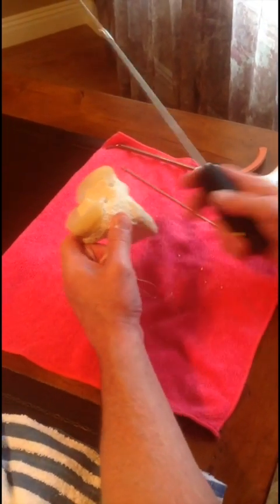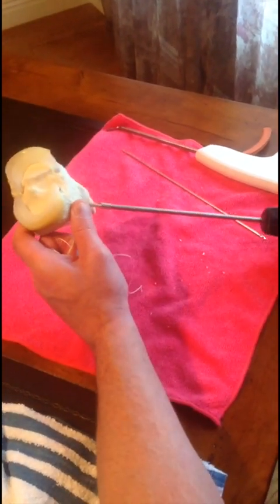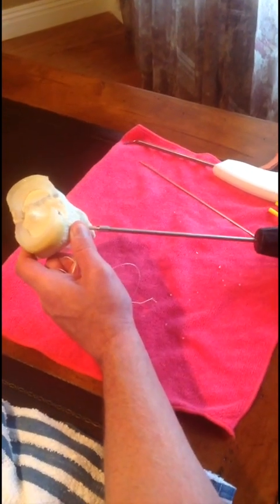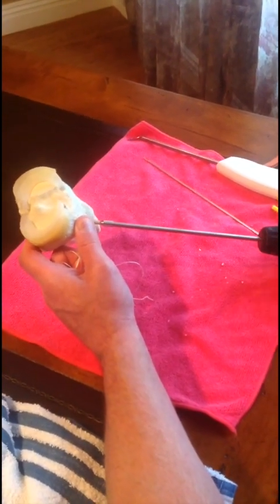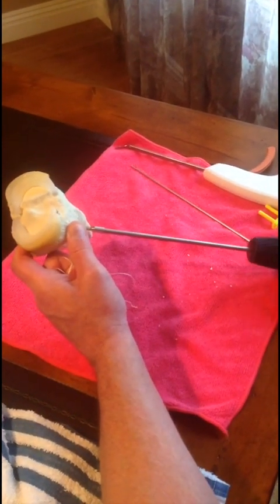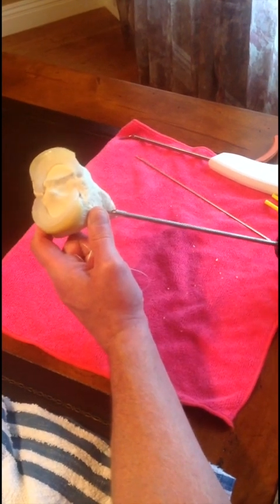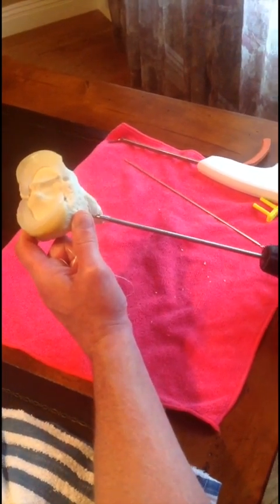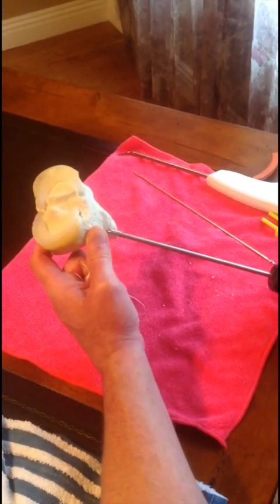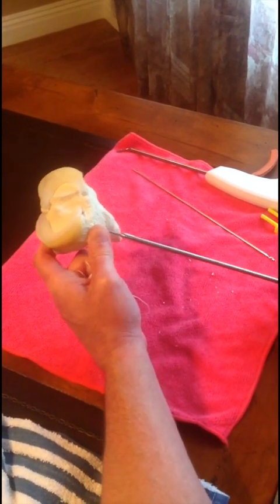There's not a great fear about cutting these sutures — I haven't had it happen to date. I'm sure it could happen, but I've also broken sutures tying over a button. We know from securing sutures with regular suture anchors that they tend not to break just from the anchor going past them. So in this case I'm able to precisely control the tension. I'm looking arthroscopically to make sure I've got it seated down onto the root repair site, and I can advance my anchor fully to depth without increasing tension on the repair site, thereby recreating an anatomic root repair.